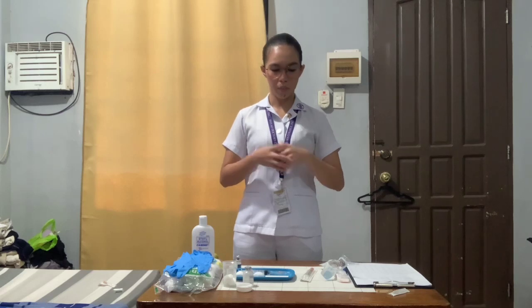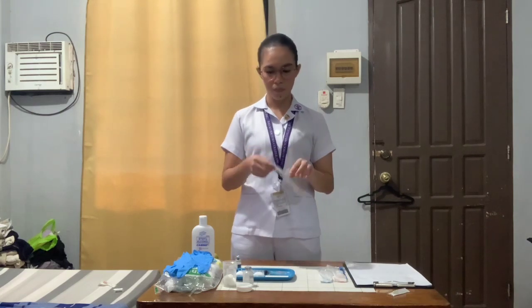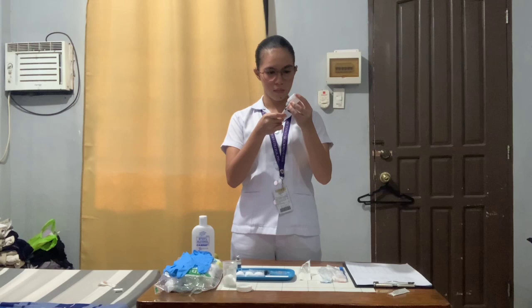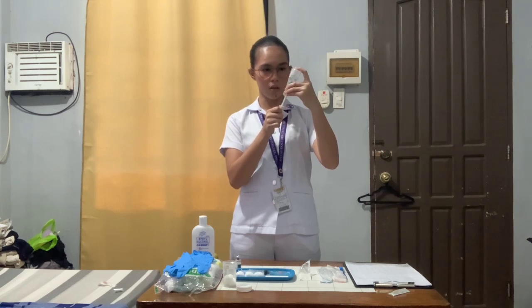So now after that, I'm going to proceed in preparing the medication for our subcutaneous injection. So I have here my insulin syringe. For this one, I will be using sterile water as the medication. We're just going to withdraw the medication. So now we are going to draw the medication into the syringe with its right prescribed units.